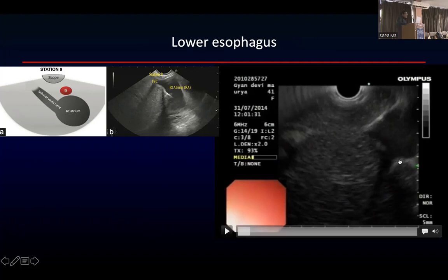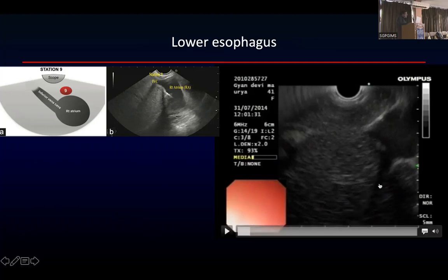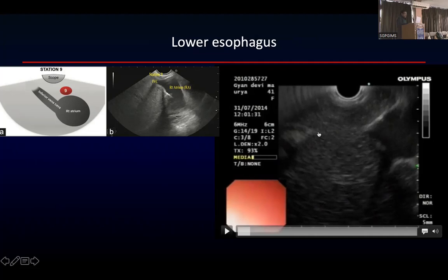RHV has a wider opening while it goes into the IVC. So RHV is not uniform throughout its course. It has a wider neck when it inserts into the IVC, and then it starts tapering. This is what the RHV is. When you are seeing RHV, you are seeing the intrahepatic portion of the IVC. This segment here is segment 1. Okay, good. You are seeing the intrahepatic portion of the IVC. This is RHV. What is this segment?